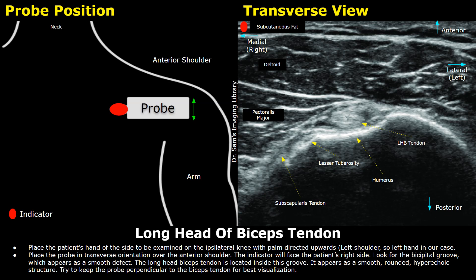Hello everyone, this is Dr. Sam, and today you will learn how to scan the long head of biceps tendon on ultrasound.